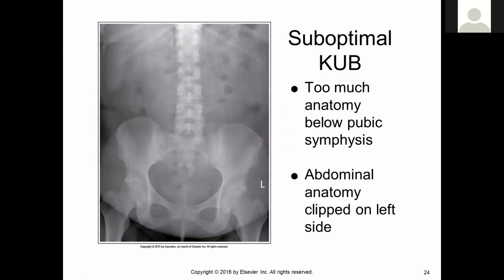If you have a patient with a lot of fatty tissue, it's not necessary that you include all of that fatty tissue, but you do need to see the intestines visible. So we're close on the right side here. We've clipped up top, we've clipped on the left.